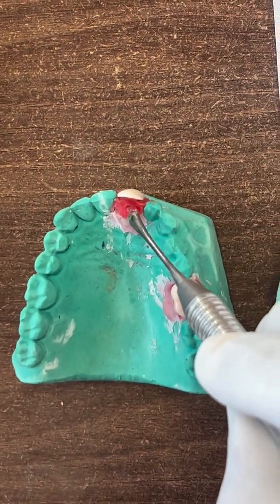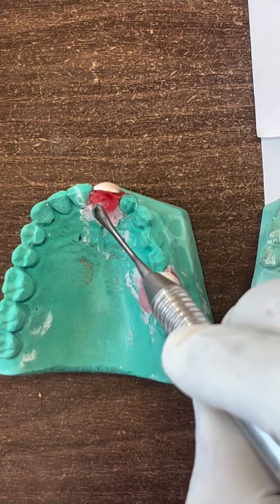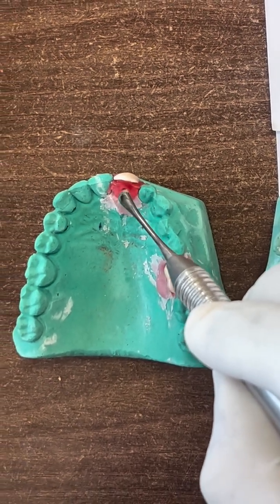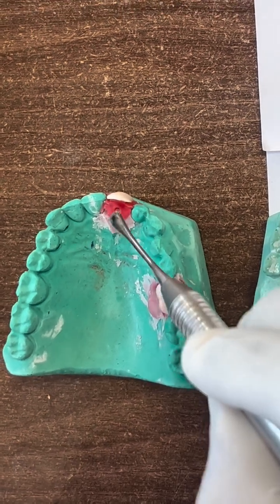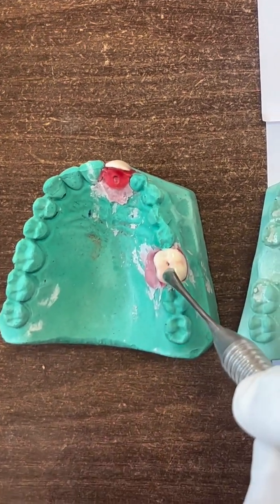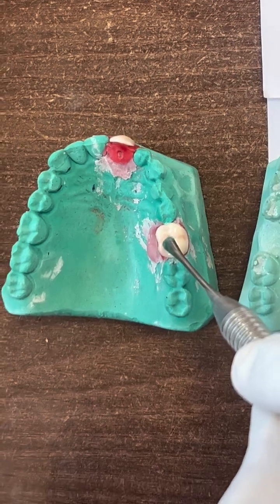So if it is a case of replacing anteriors, then we need to start drilling at the cingulum area. If it is a case of a posterior tooth, then the drilling should start in the center.